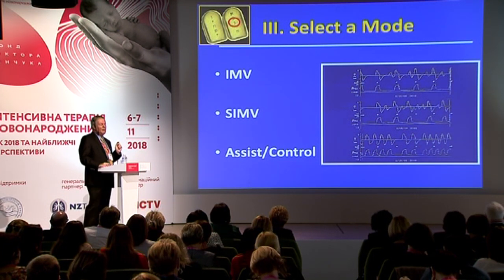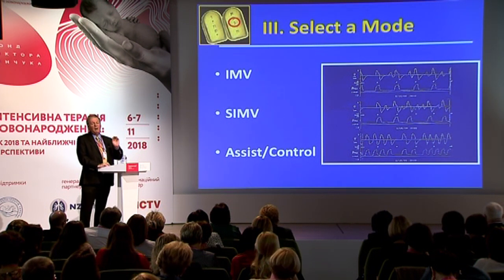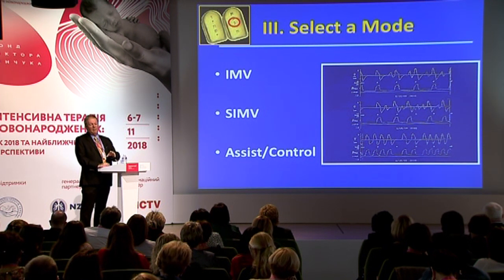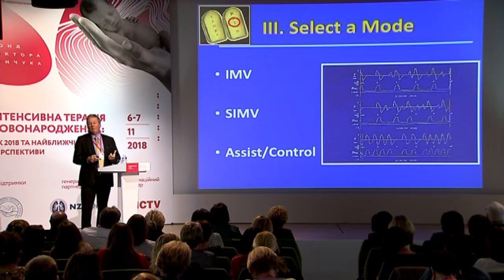And if we synchronize expiration, which we'll talk about in a second, we can have 100% synchronization between the baby and the ventilator. So in essence, now, instead of the clinician guessing what to do, the baby can tell the clinician exactly what he wants.